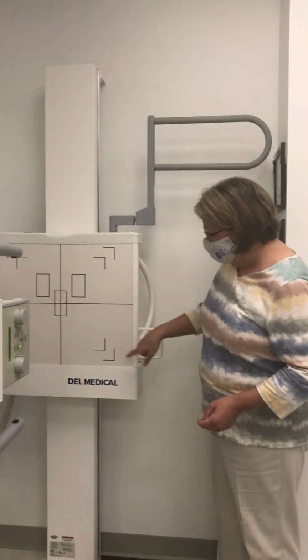So the air fluid levels can be demonstrated whether or not the patient is erect or on the table, as long as we have a horizontal beam. Now then, since I'm at the wall bucky, I know I'm going to set my SID, set that detent. I blow right past 72 because for the abdomen, our SID is 40 inches. I know that I'm locked into that 40-inch SID because that light is on next to the green button.